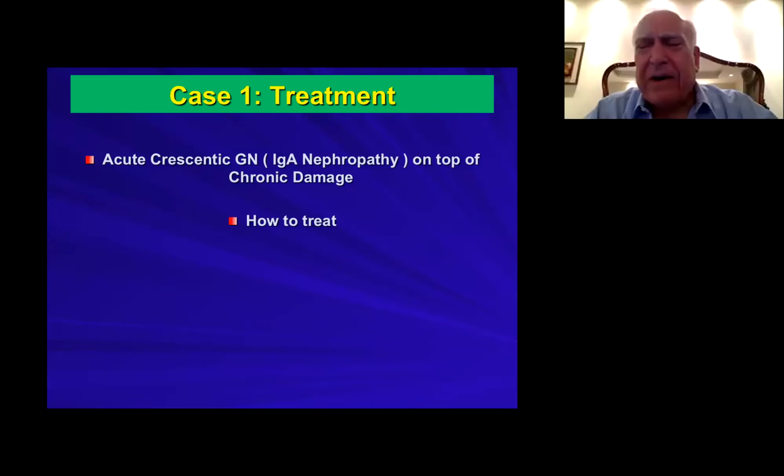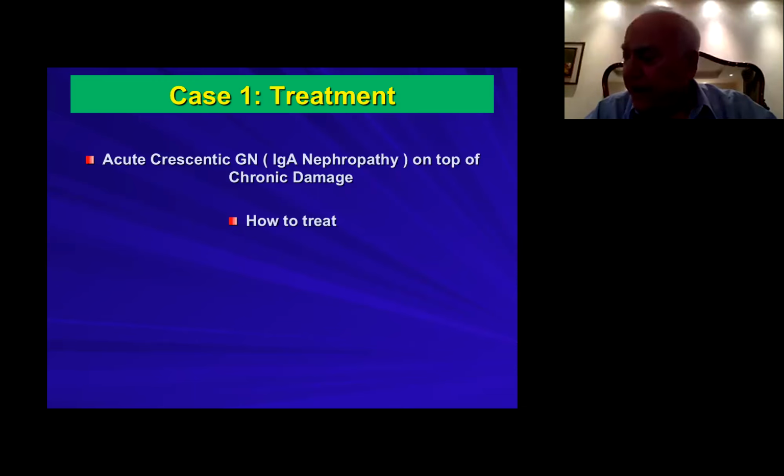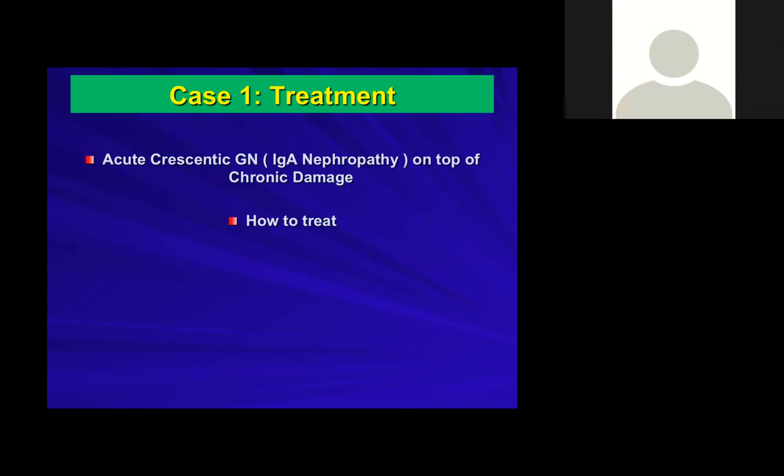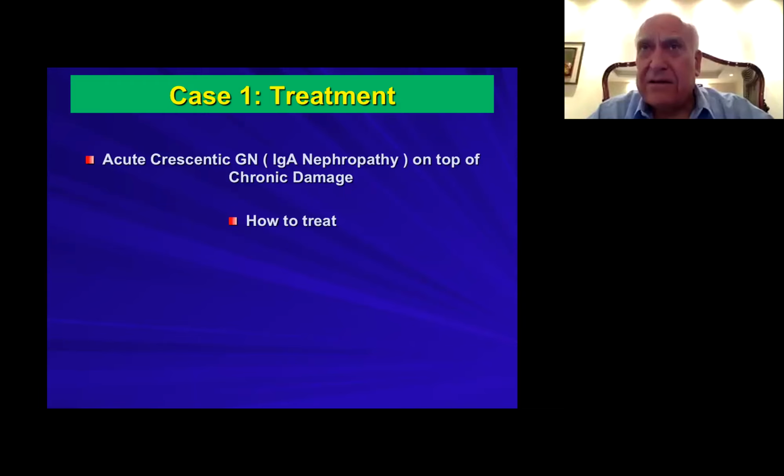You have to remember that until recently, the Oxford classification did not include crescents. Now they have started adding C, for crescents, to the classification.